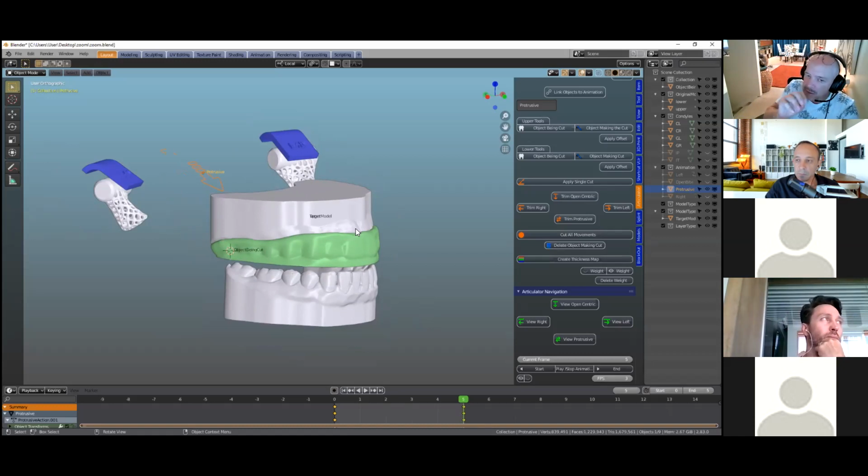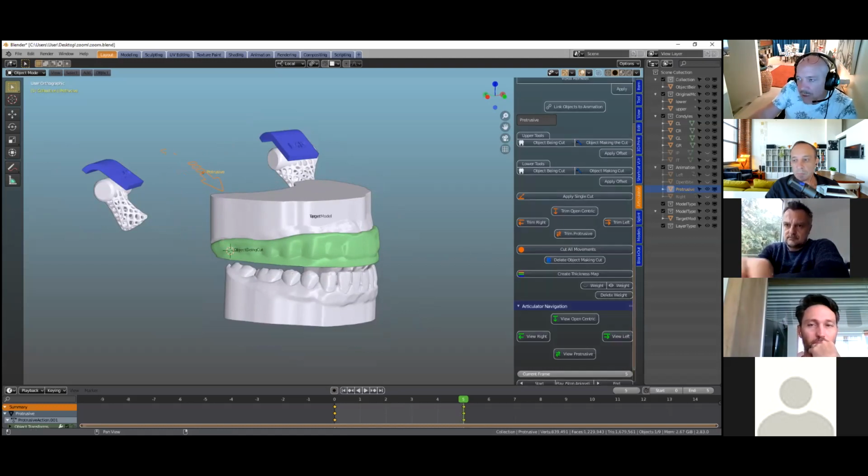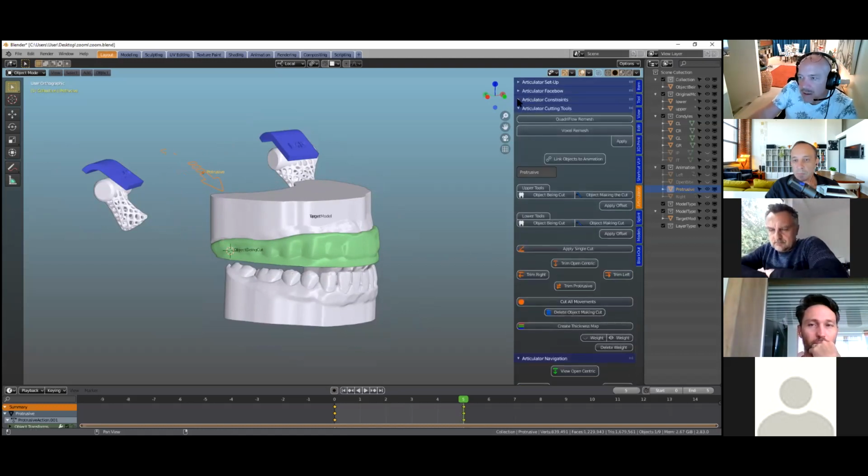If we pull this little protrusive arrow down a little bit and permanently set it, then I think we can get quite close with that. But it's still early stages. If we had more data on all of that, we could say, do this and this and this, and then we would be in a different situation.